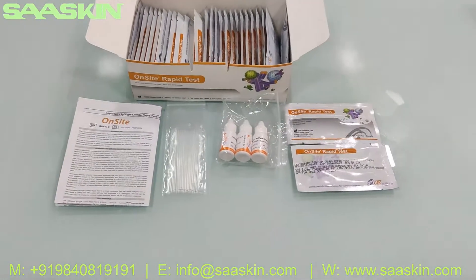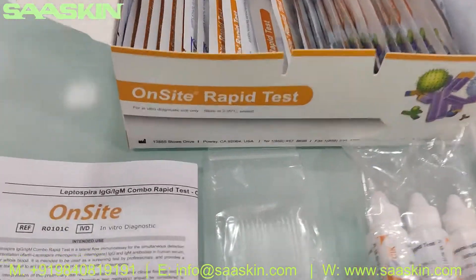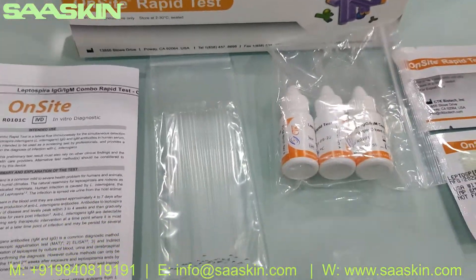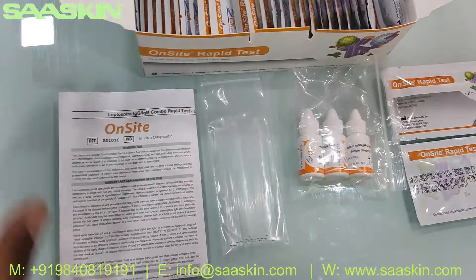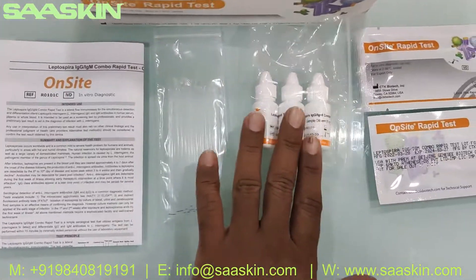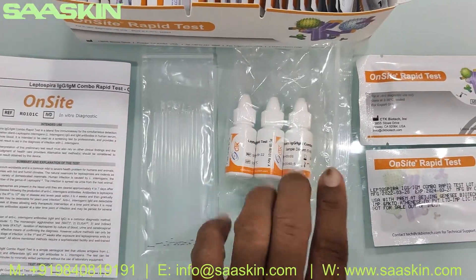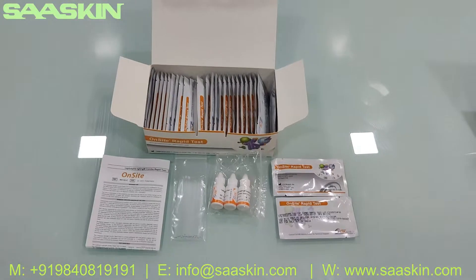So here is a quick summary. This is from CTK Biotech, and this is the OnSite rapid test kit for Leptospira IgG IgM antibody detection. In the 30-test kit box, you get one IFU brochure, 30 capillary tubes, 3 buffer bottles each 5 ml, and 30 test cassettes. This is how the complete box looks.